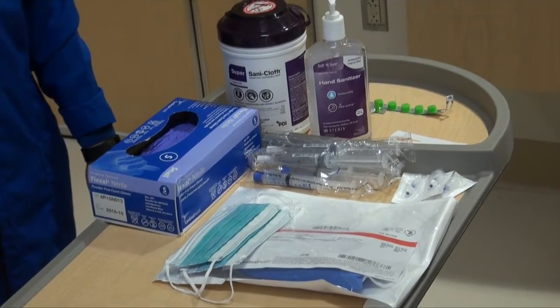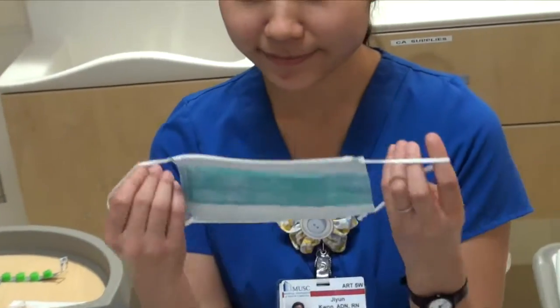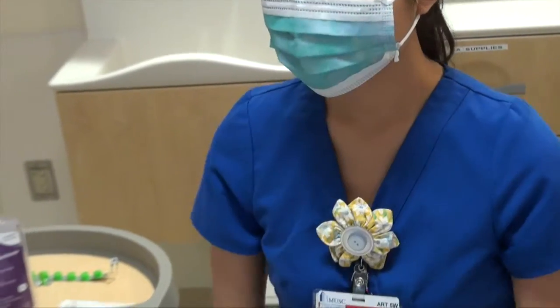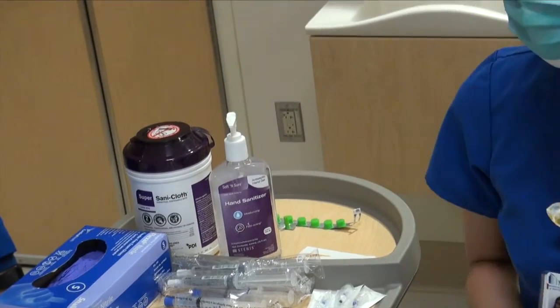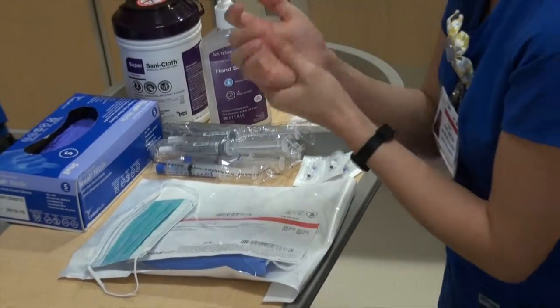Step 1, you want to put on a face mask and keep a mask on throughout the entire dressing change. Everyone within 3 feet of the patient should have on a mask. Wash hands with soap and water for at least 30 seconds or hand sanitizer. Once your hands are dry, put on clean gloves.